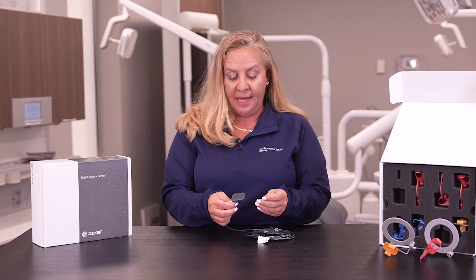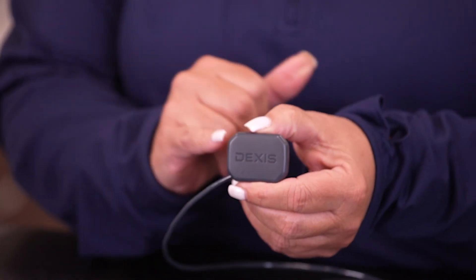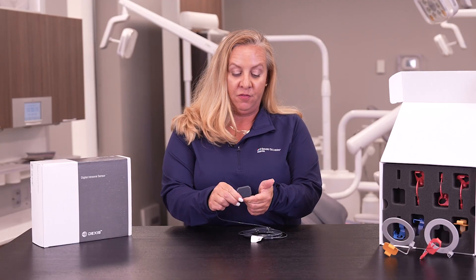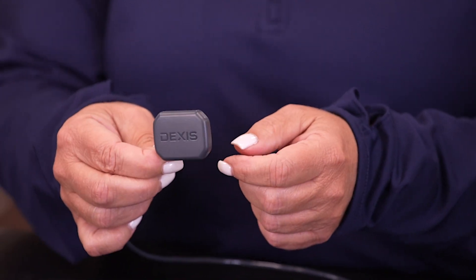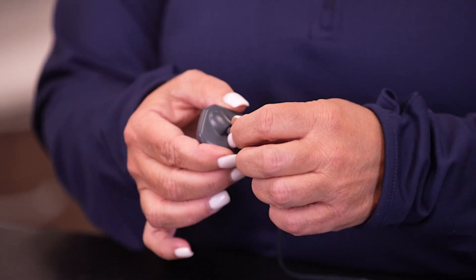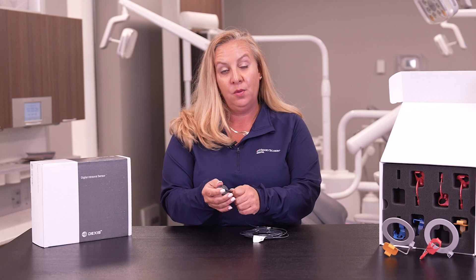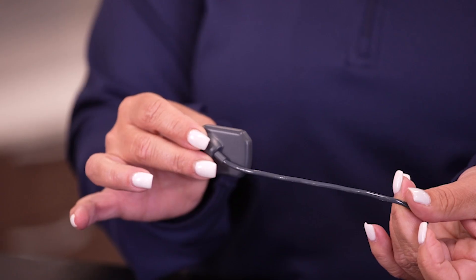I just want to highlight some features of the sensor itself. If you look closely, you can see the edges are rounded off, which is for patient comfort and ease of placement when putting it into the patient's mouth. The cable coming out of the back of the sensor is at a 45-degree angle, which ensures stability so we're not going to loosen the cable, and again provides comfort for the patient as you bring it out of their mouth.